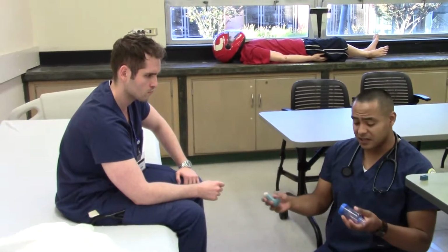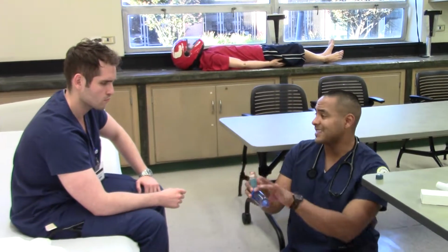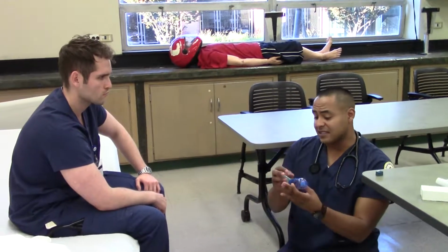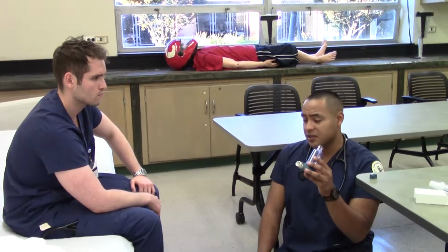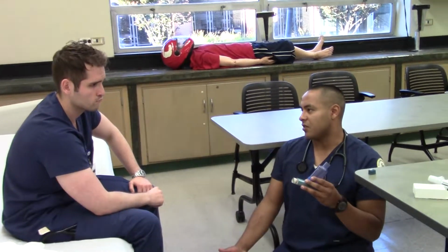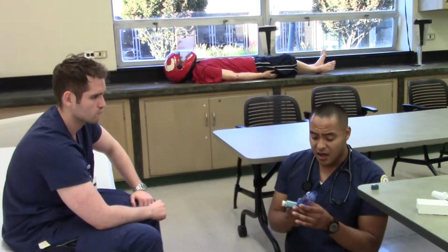The spacer allows you to push the medicine out. Then that medicine just sits there, okay? So as opposed to just timing it, the gas sits here, it waits for you. So now you can just get ready for it. You just breathe out and then breathe in. So the medicine just sits there and waits for you. So that's why it's easier. It's better coordination, just easier use.